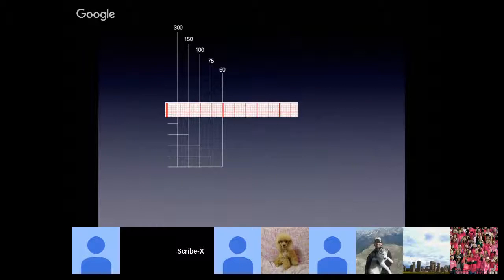You can get a sense for the heart rate on the EKG without looking at the machine interpretation, which, by the way, is often wrong. You can get a sense for the rate based on counting big boxes. So if a QRS occurs once every big box, that's a fast heart rate. That actually equates to about 300 beats a minute.